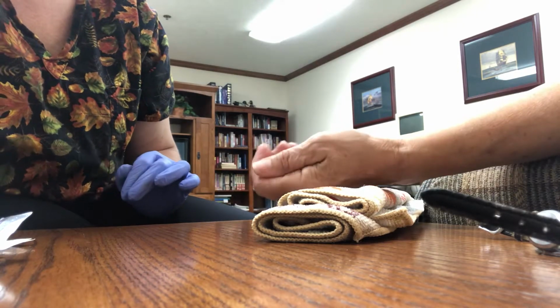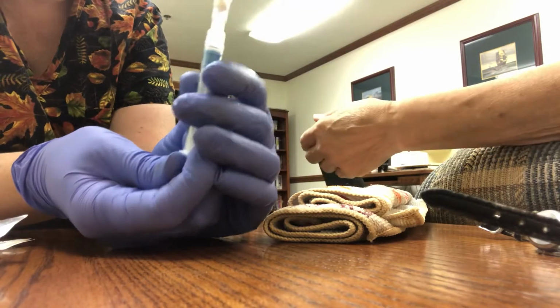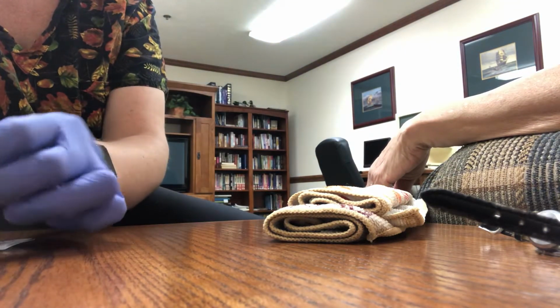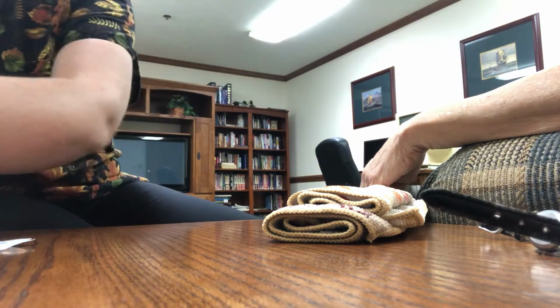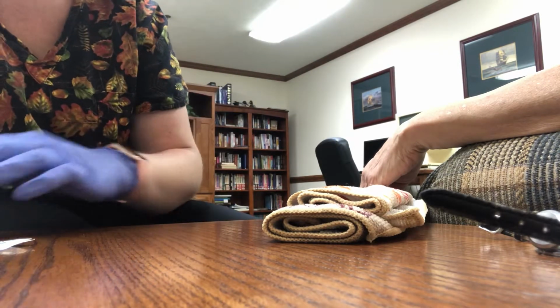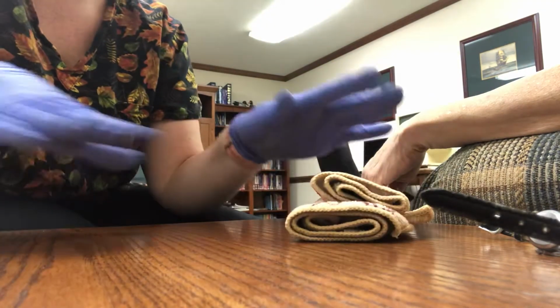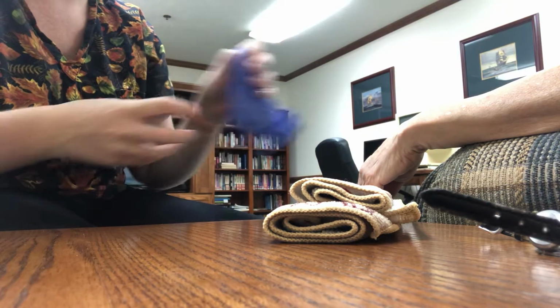So then I'm going to take my sample, and I'm going to blow any air that might be in there out. This is going to get labeled with the label that's filled out with your information. It's going to get placed into my biohazard bag and sent to the lab. And then all of my sharps are going to be placed into a sharps container, and I'll have to disinfect the area. Do you have any questions for me, Cheryl, about what we did today?